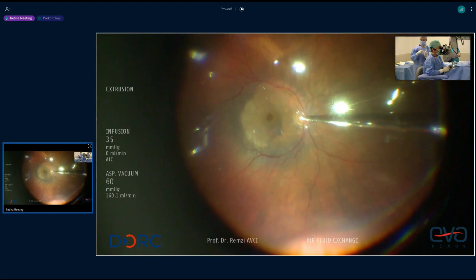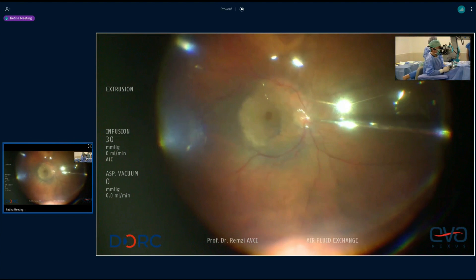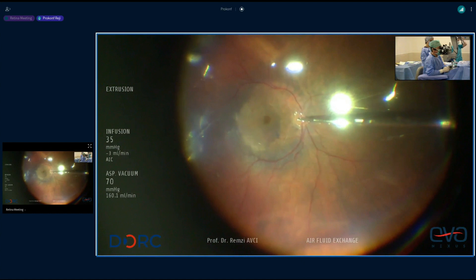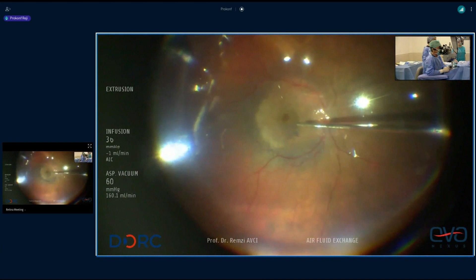It's also useful to note he does it on the nasal side of the disc, so the fluid will travel across the flap and help keep it in position. This is a textbook case. You always aspirate over the optic disc, and during aspiration this also helps keep the flap in place, because the fluid accumulation flows from that area toward the optic disc.